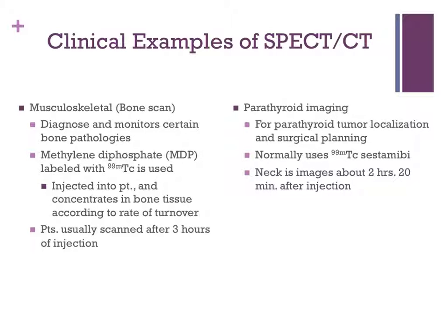It is also used for parathyroid imaging, for parathyroid tumor localization and surgical planning. And normally, a radiopharmaceutical such as Tc-sestamibi is used. The neck is imaged about 2 hours and 20 minutes after the injection.